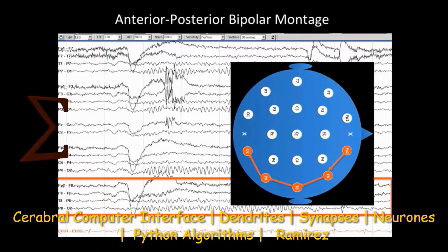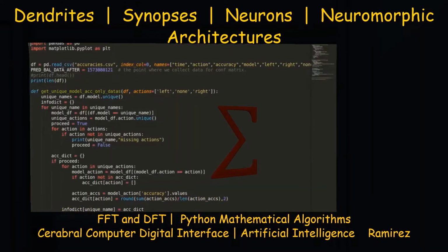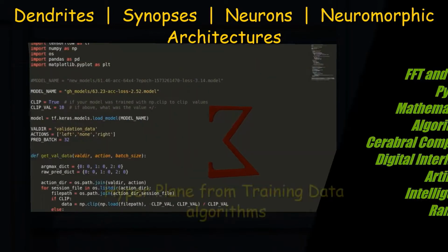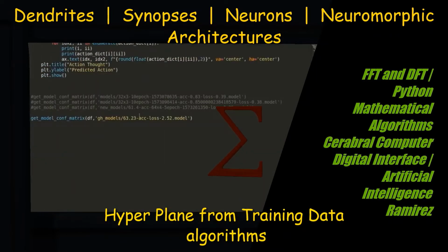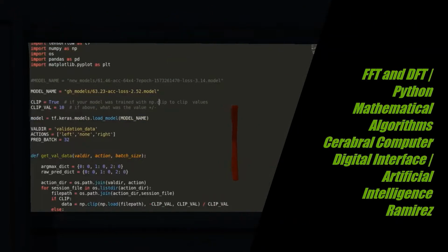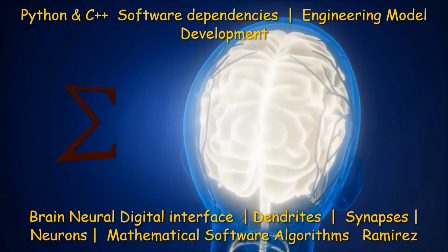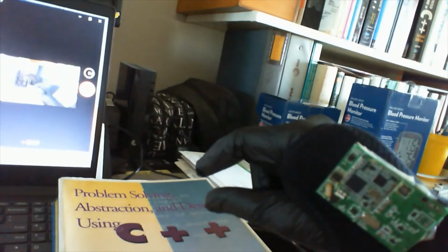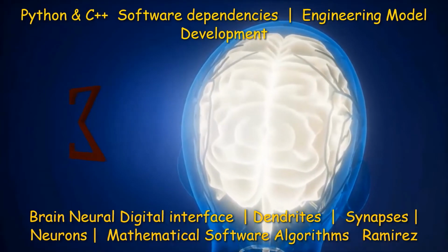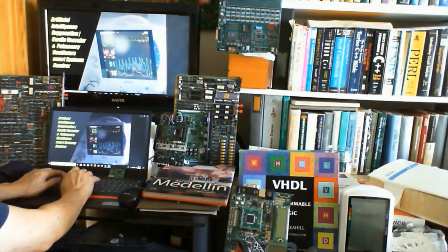Basic design methodology. Oscillatory activity-based BCIs are based on changes in power in some frequency bands in some specific cerebral areas, where they naturally need to exploit both the spatial and spectral information. So here is an example, a basic design for motor imagery.